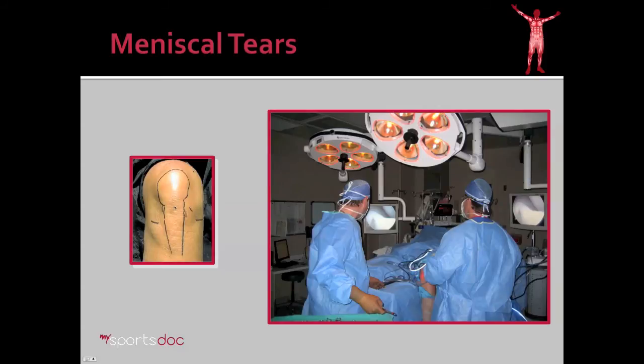There are usually two incisions, only about a centimeter in length, on either side of the patellar tendon. We insert a camera through one incision and instruments through the other to perform our work. Here you see the operating room with two high-definition screens — one for the surgeon and one for the assistant. Interestingly, you can see in the background this is actually a bucket handle type tear, which would be repaired in many cases rather than excised.